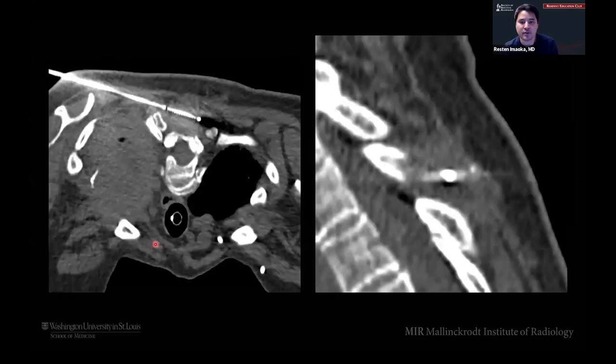And so what we do here is we do our cryoablation. We put in some probes through the lesion. We place them in a way that we know the ice is going to form, right? Depending on what vendor you're using and what probe you're using, you know the size that that ice ball is going to make. And so we can place it here and then watch it sequentially with CTs so that you can see where that ice ball is going. And that's the benefit of cryoablation and CT in general, right?